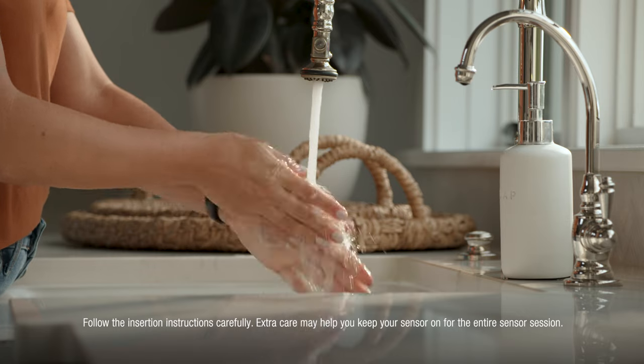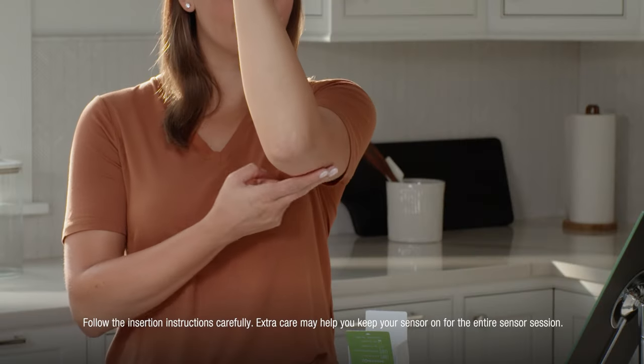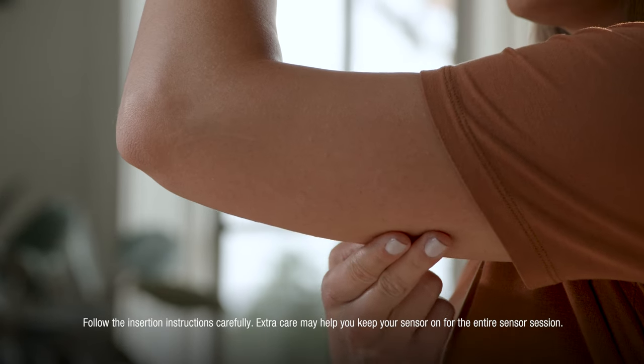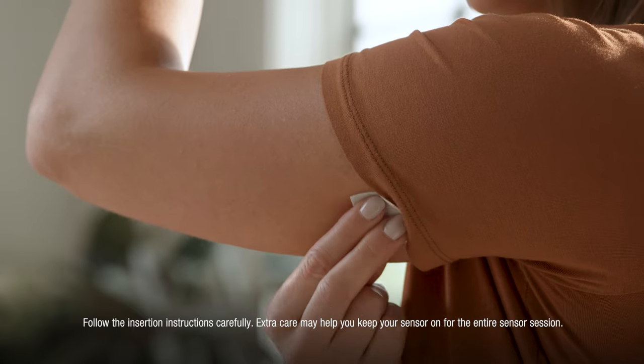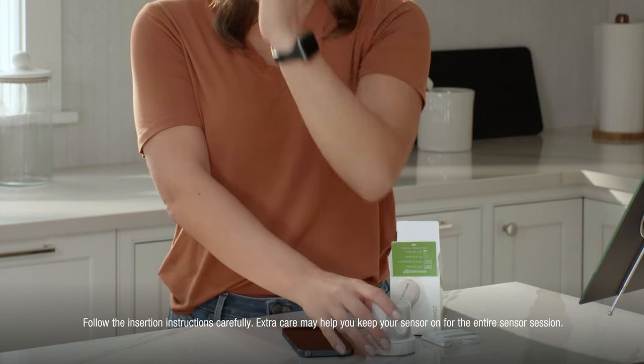Before you begin, wash and dry your hands. Choose a site on the back of the upper arm with enough fat to avoid muscle, and a site that is not likely to be bumped or pushed. Clean your site with an alcohol wipe and let it dry for at least 10 seconds. Grab your applicator and unscrew the cap.